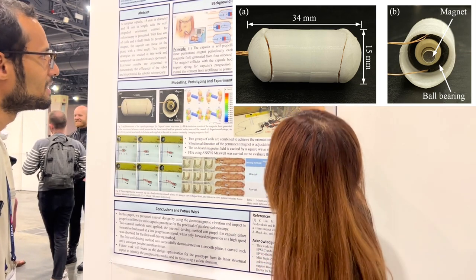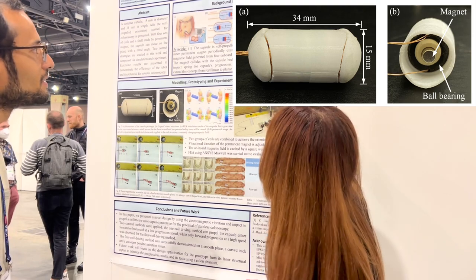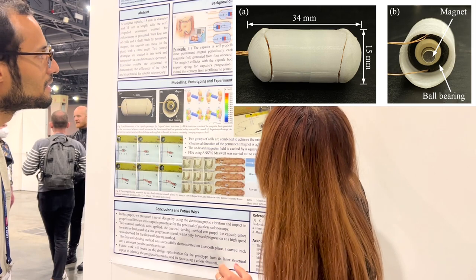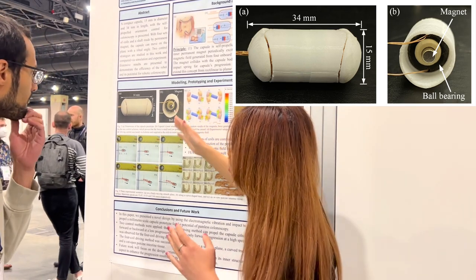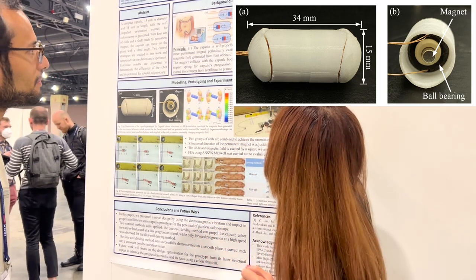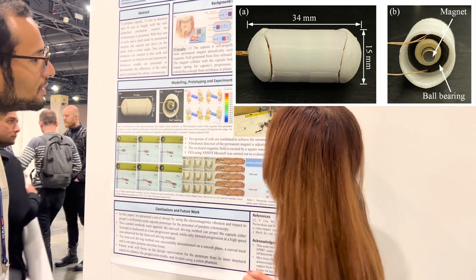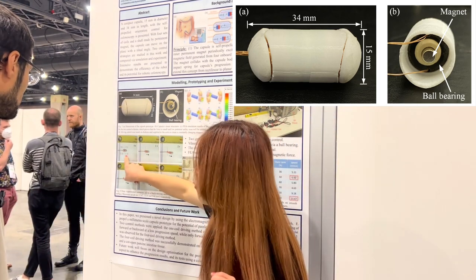When you turn on B1 and B2, the magnet — the blue one — can just lock in its position. And because this is a freely moving ball bearing, it needs the force to be locked in that position so that A1 and A2 can work. In this setup, A1 and A2 are vibrating the magnet, and the capsule can move backward-left or forward-right.